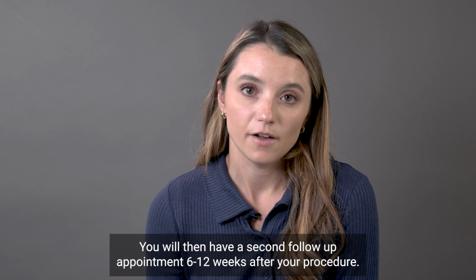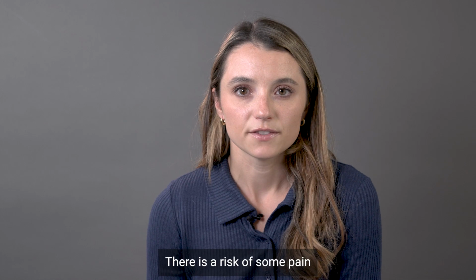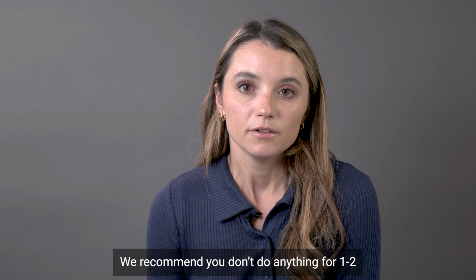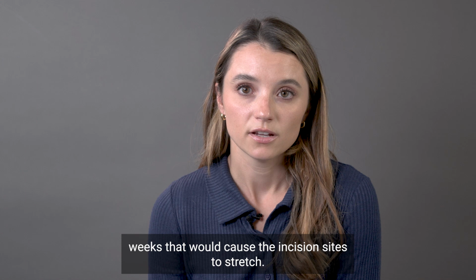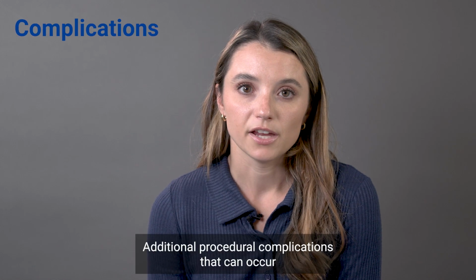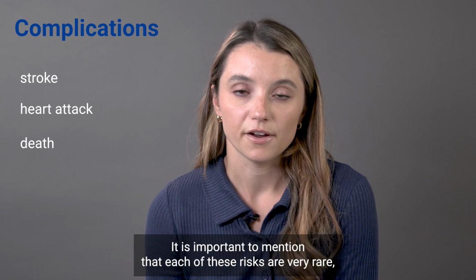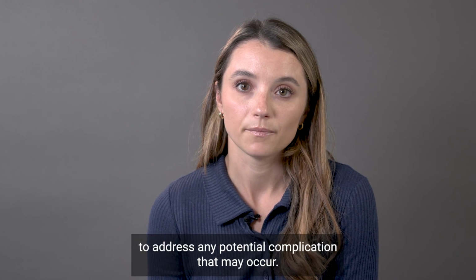You will then have a second follow-up appointment 6 to 12 weeks after your procedure. There is a risk of some pain or discomfort at the incision site, bleeding, infection, and swelling. We recommend you don't do anything for 1 to 2 weeks that would cause the incision sites to stretch. A separate video discusses all of the restrictions you will need to follow after your procedure. Additional procedural complications that can occur include stroke, heart attack, and death in extremely rare cases. It is important to mention that each of these risks are very rare, and your care team is well equipped to address any potential complication that may occur.